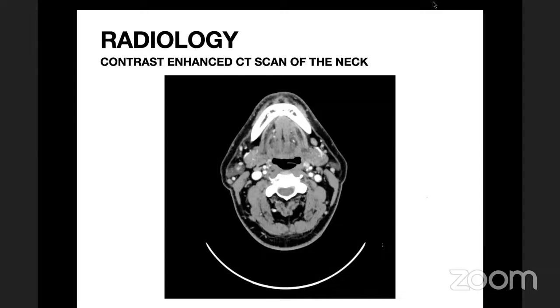So you could either give bilateral off-cord lateral fields or you could give it with a little bit of an anterior angulation. Yeah, but where are the cords here? When you say off cords, what do you mean? So off-cord meaning spinal cord, sir. Spinal cord. Okay. Yes, sir.